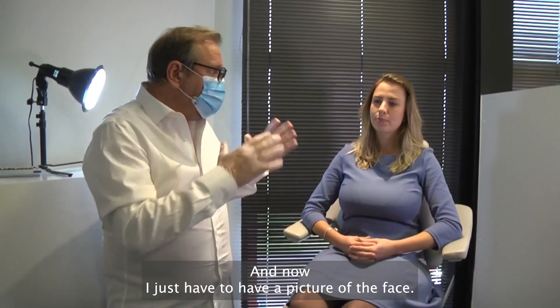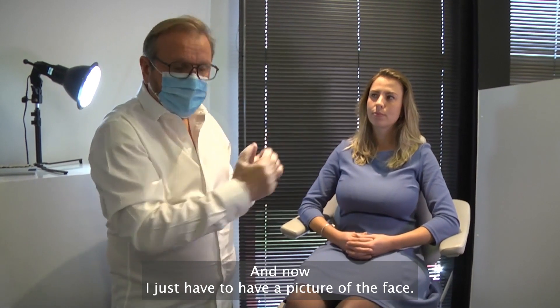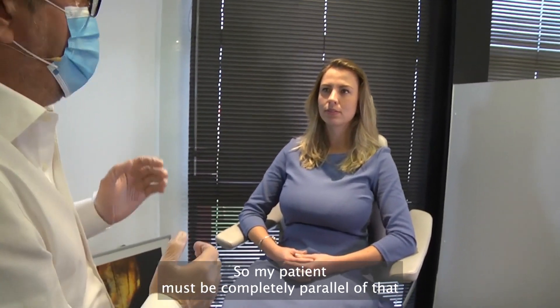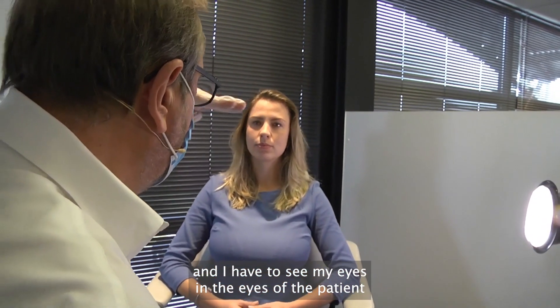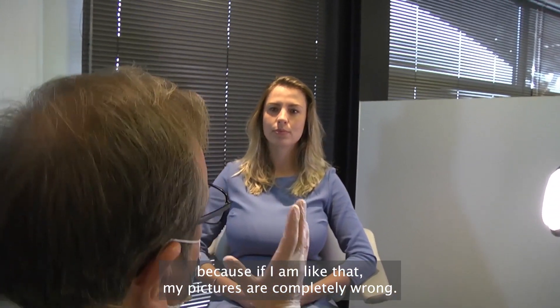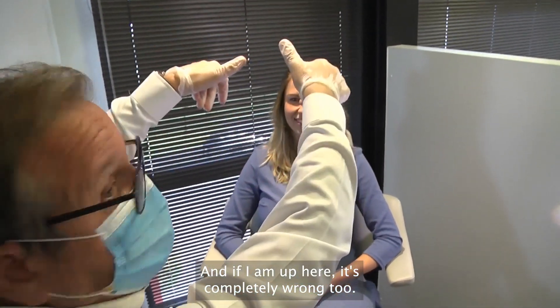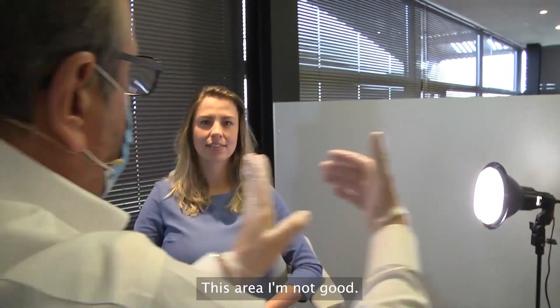Now I just have to take a picture of the face. My patient must be completely parallel for that. I have to see my eyes level with the eyes of the patient, because if I am positioned like this, my pictures are completely wrong. And if I am up here, it's completely wrong too.